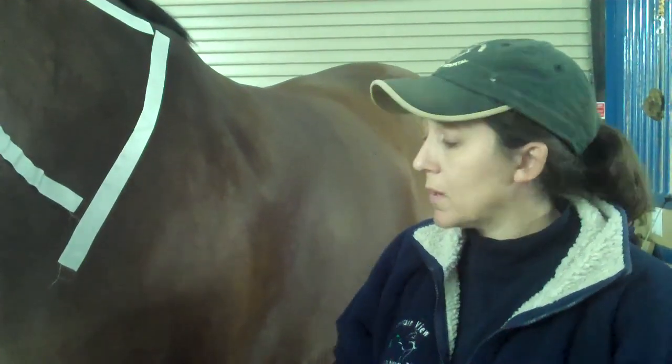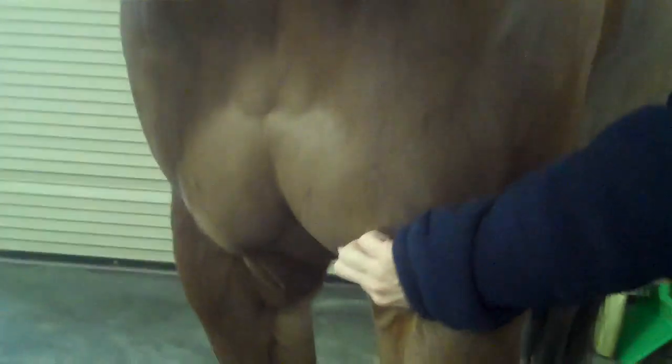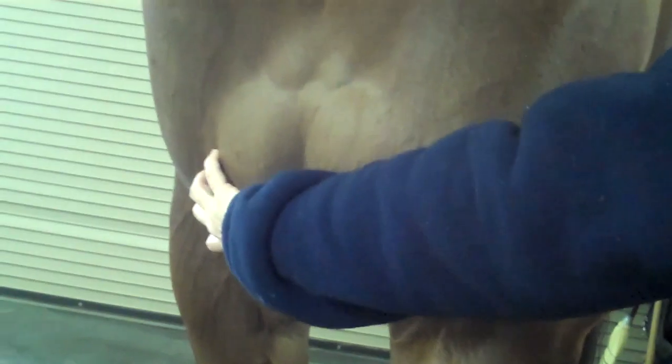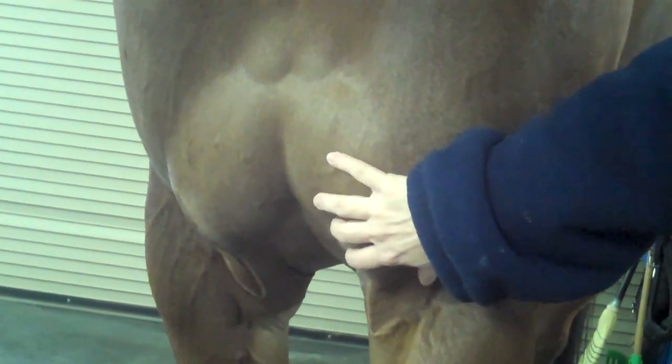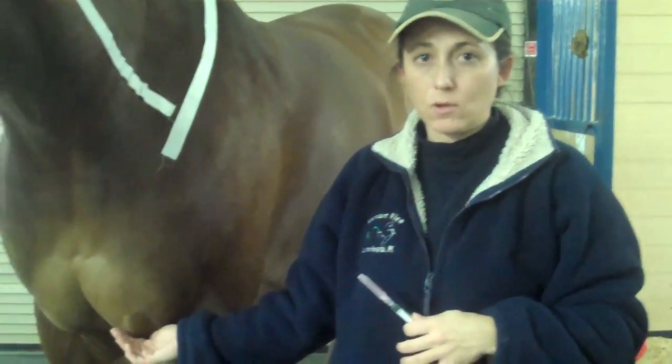Other places you can give intramuscular shots are underneath in the pectorals — there are two good muscle bellies right in there. The downside is that sometimes they'll get swelling associated with that and can actually swell quite a bit, so it's not necessarily the ideal location.